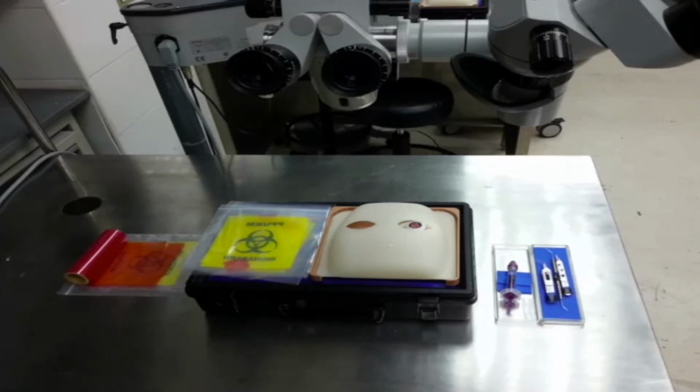Most of the time, when we do phaco, definitely you know that you need a phaco machine. The phaco machine in our wet lab is so far not functioning. A phaco machine also has a lot of disposable items that you need to use. But without the phaco machine doesn't mean that you cannot practice your phaco emulsification. You can always practice the CCC and even the can opener with the Kitaro set. These are basic instruments that you need to use.